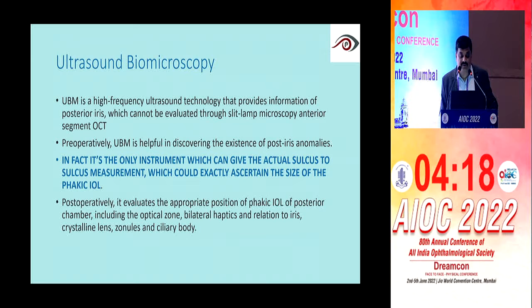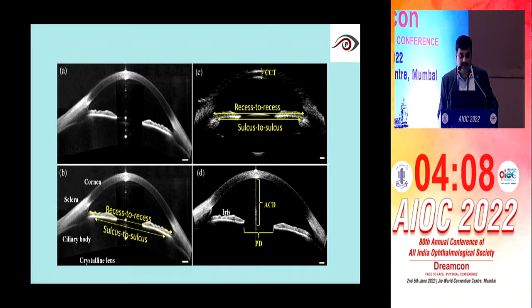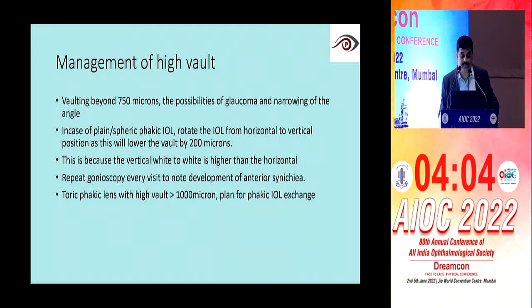Postoperatively, it evaluates the appropriate position of the posterior chamber phakic IOL, including the optical zone, bilateral haptics, and relation to the iris, crystalline lens, zonules, and ciliary body. This is what we see in ultrasound biomicroscopy.